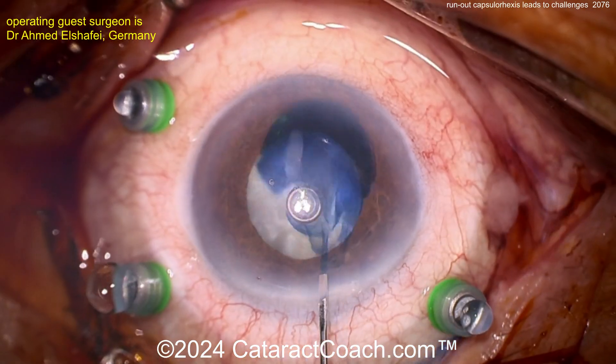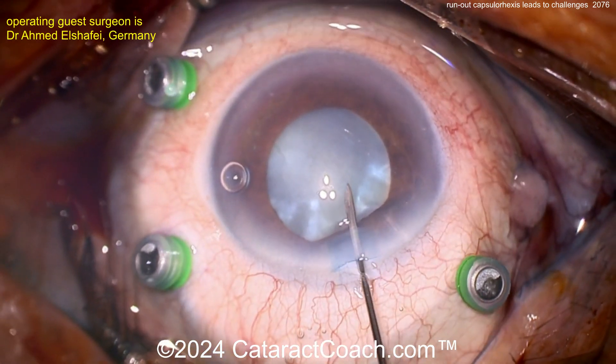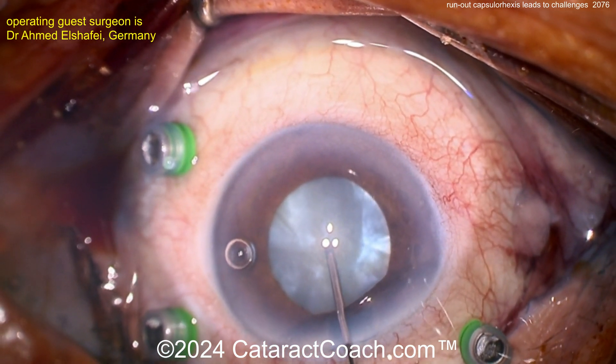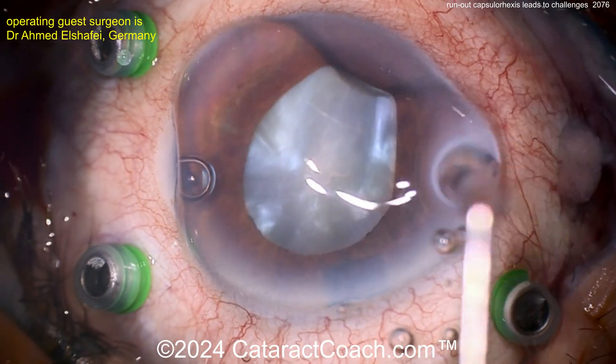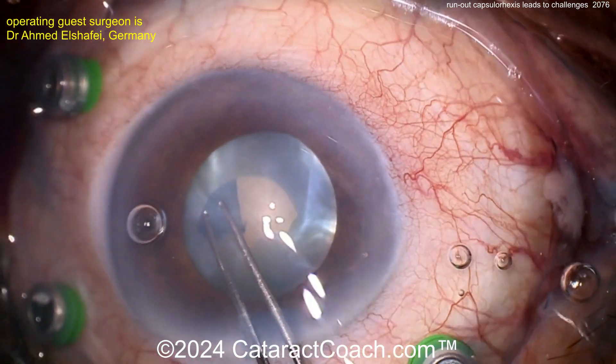Making the incision — there's a little trypan blue dye. We've obviously sped up the video. There's the viscoelastic. Let's get the lens decompressed, so poking in with the needle — needle decompression. I like that technique too. And then more viscoelastic. There's some HPMC on the cornea. Let's get this rexis done, and here comes the rexis.